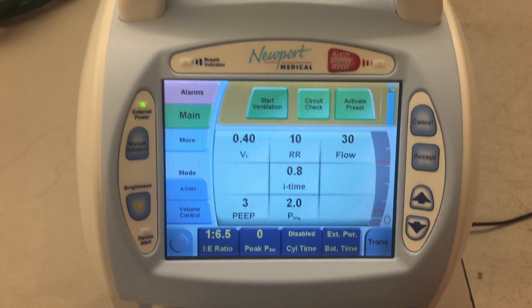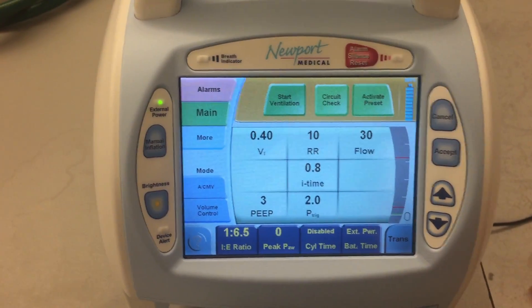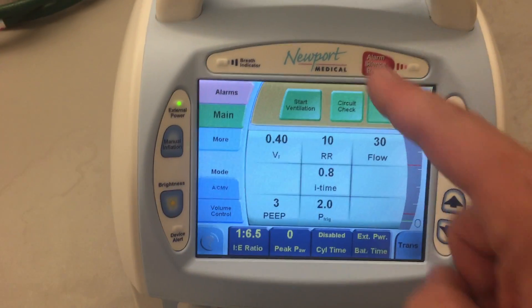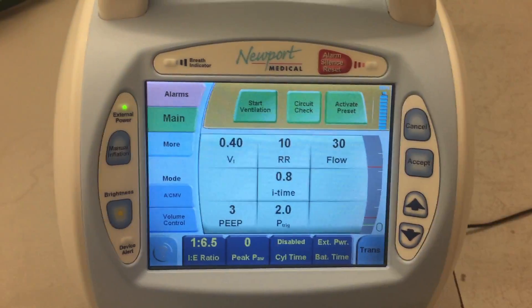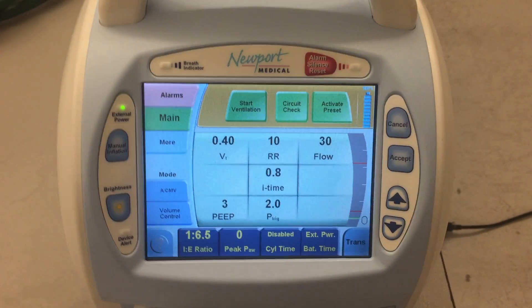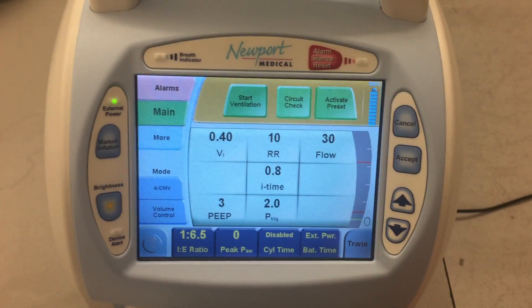So this is the main screen — this is where we start. If I wanted to do a test of the circuit, I would just hit the green button that says Circuit Check, and I could touch that. Then you hit Accept every time you want to confirm that you want to do something. We're going to defer the circuit test today and just talk about the basic setup.